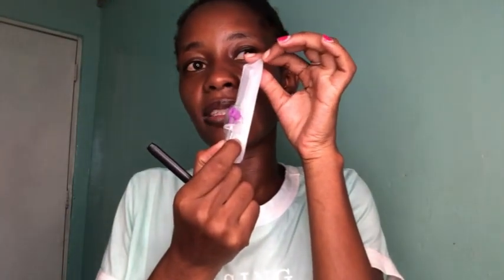We have the injectable injection cap. This is called the injection cap, the colored part. And then we have the luer lock. The luer lock is this one, where after you have injected the patient, you can use it so that you don't get the flashback, or you can use it to control the flow of blood before you remove the needle.